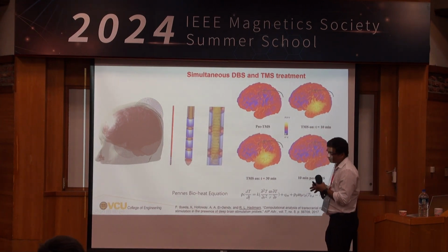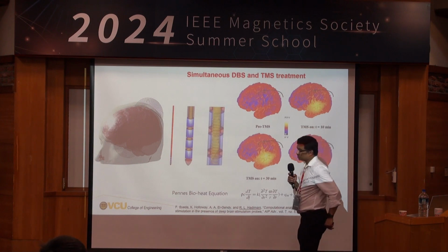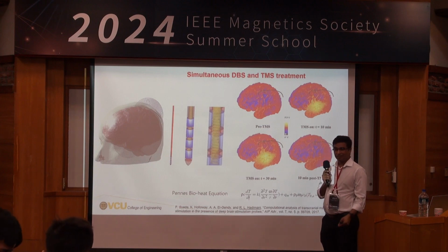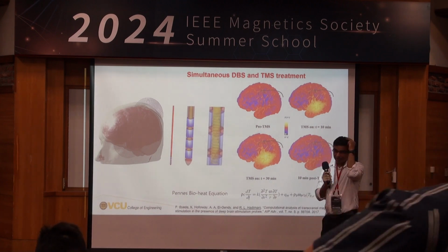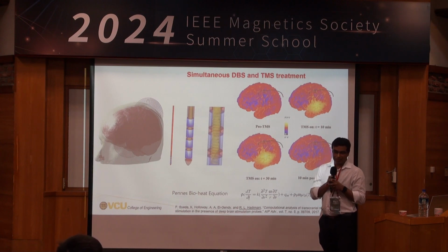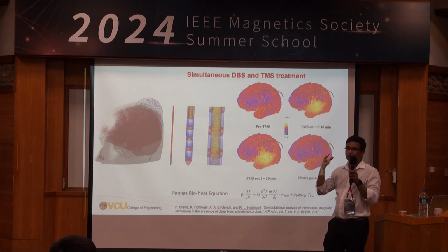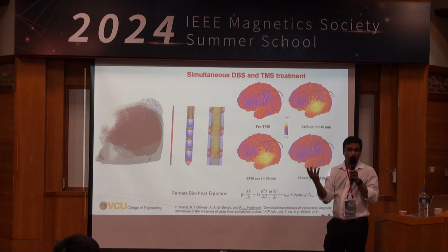Right. So that is DBS. I've attended 2 such surgeries. It's amazing to watch. When they are inserting the lead, the person is awake. They only anesthetize the person when they drill the hole on the skull. But when they are inserting, they insert millimeter by millimeter, and there is a CT scan that is constantly showing where the lead is, and every millimeter they check whether the person is having all the functions.